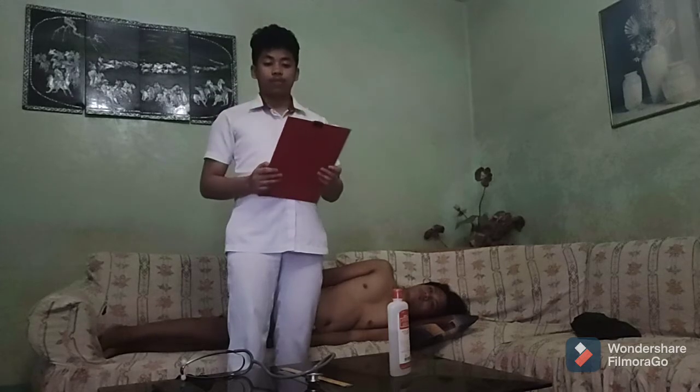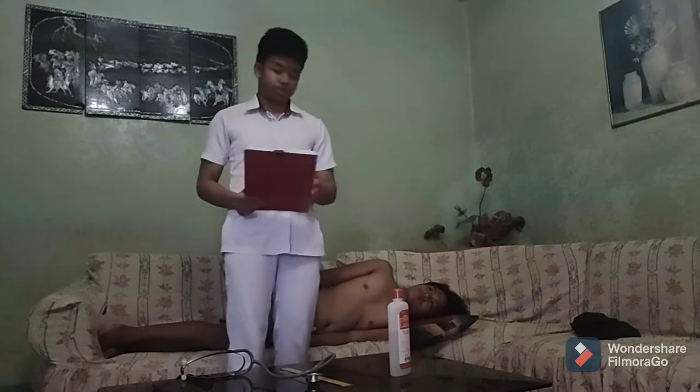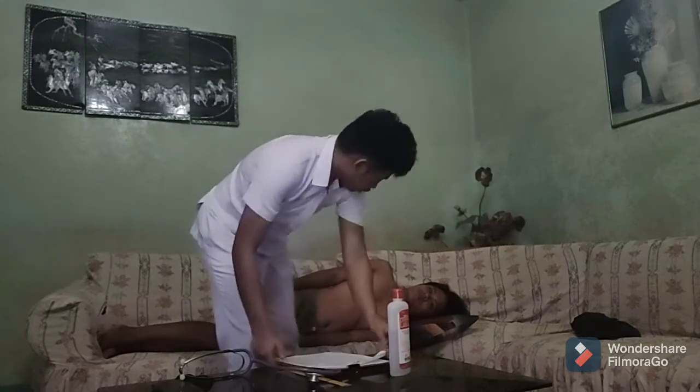Next is to ask the client to sit up, lean forward, and exhale. Use the diaphragm of the stethoscope and listen over the apex and along the left sternal border. The diaphragm of the stethoscope is best for detecting high-pitched sounds. So sir, I am going to assist you on a sitting position, sir.